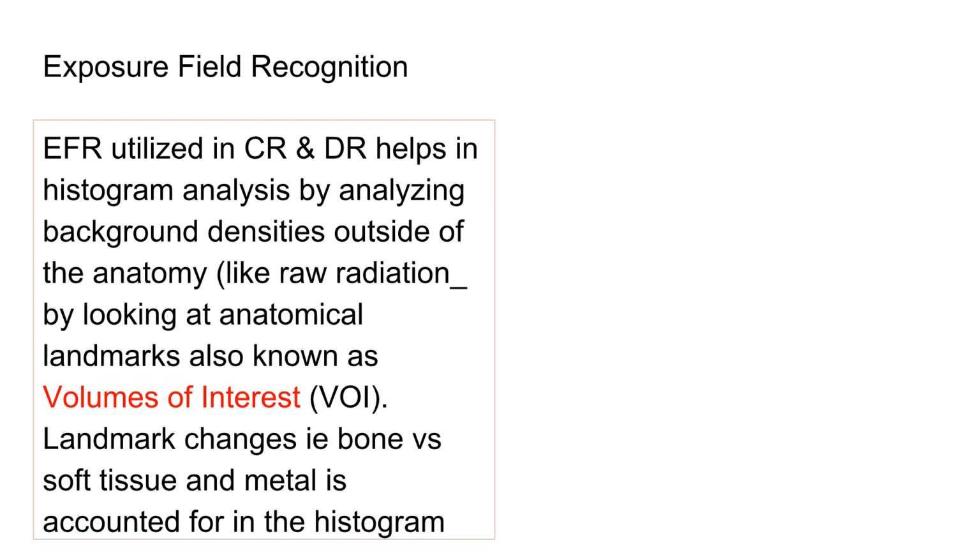Unfortunately, it can't be like pre-K, where you take the kid's hand and you trace their fingers. We don't have collimation that good, right? We can only do a rectangle. But there will be parts between fingers and outside of them where you just have raw radiation striking the image. And that's essentially going to turn into bad data if you don't recognize that.